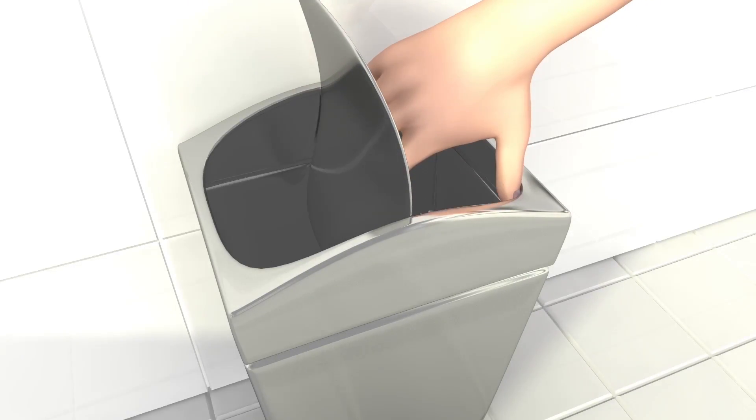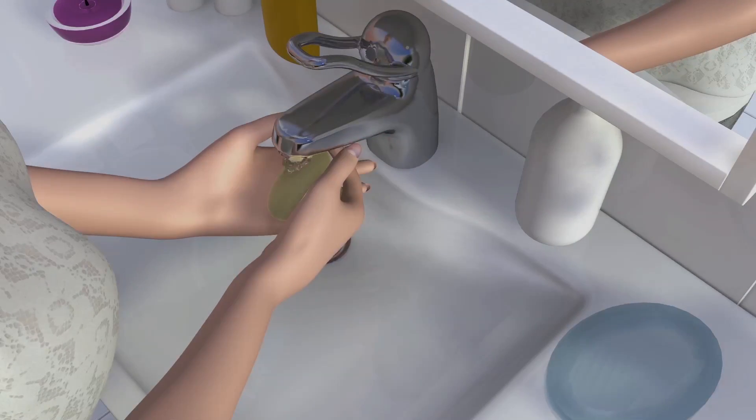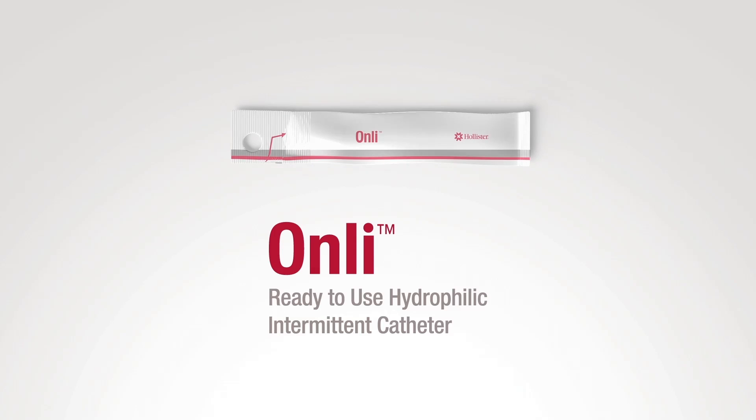Do not flush the catheter or the package down the toilet. Finish by washing your hands. Only ready-to-use hydrophilic intermittent catheter. Please visit Hollister.com for more information.